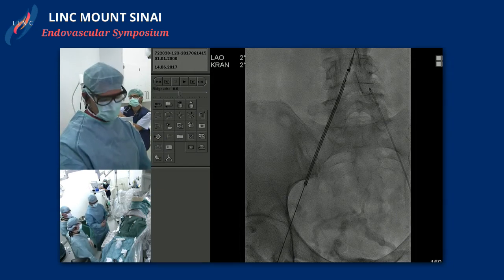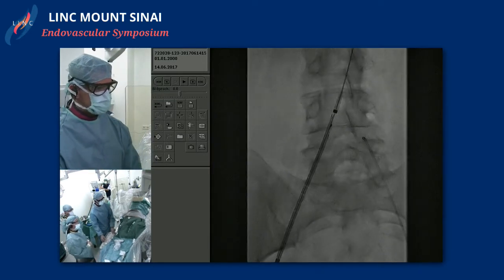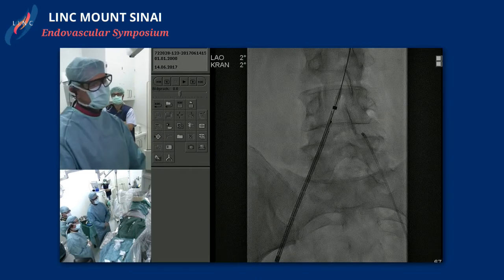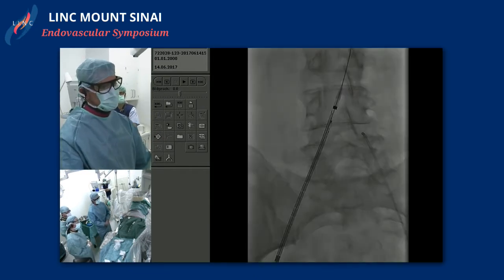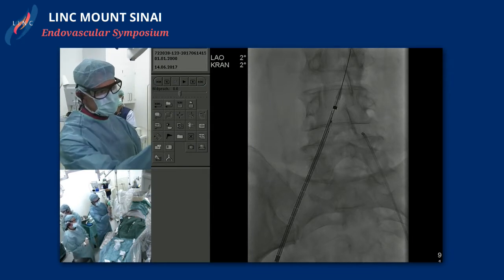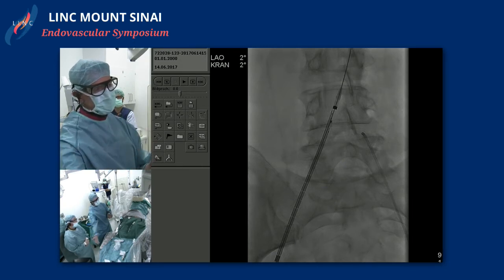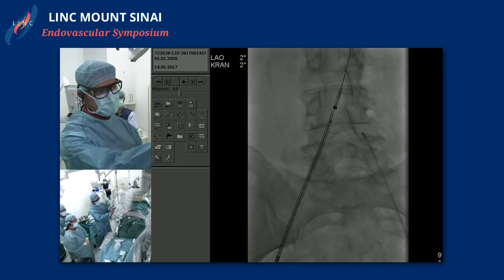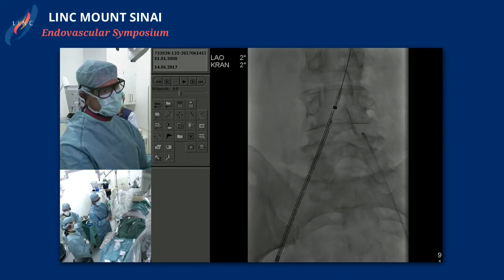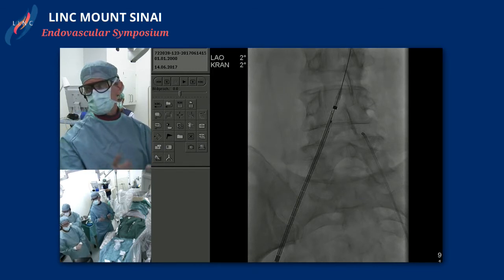And this is an open cell stent or a closed cell stent? We don't have this in the U.S., so if you could explain the unique characteristics of this. Yeah, you see, proximal you see a very strong marker, of course, the delivery system. Then you see some small markers. There are 4, and they will look to the vena cava. They will indicate where the opening of the stent will look like. And then comes a part of the stent which is relatively dense, and this is really the first 4 or 5 centimeters are closed cells, so really strong.